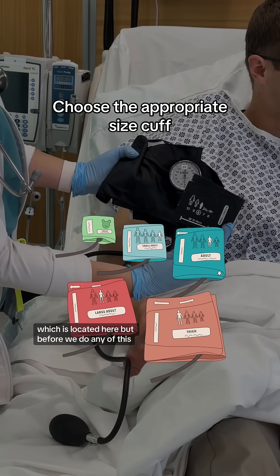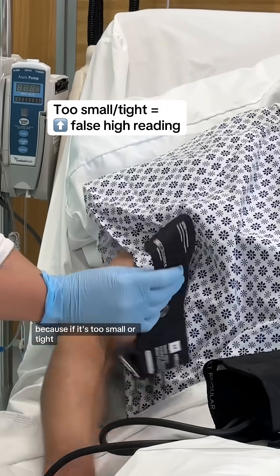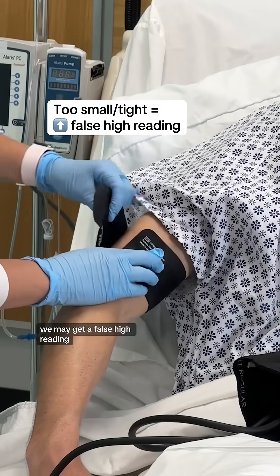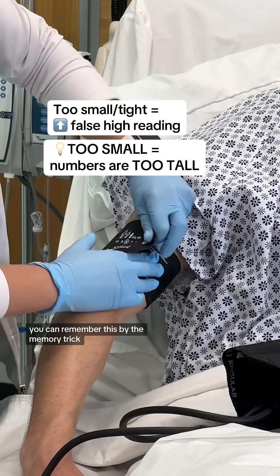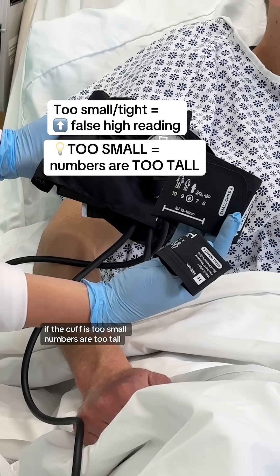But before we do any of this, we need to choose the appropriate size cuff. Because if it's too small or tight, we may get a false high reading. You can remember this by the memory trick: if the cuff is too small, the numbers are too tall.